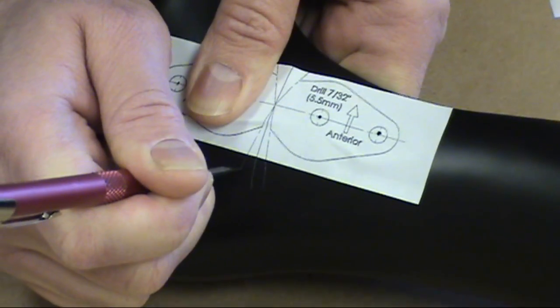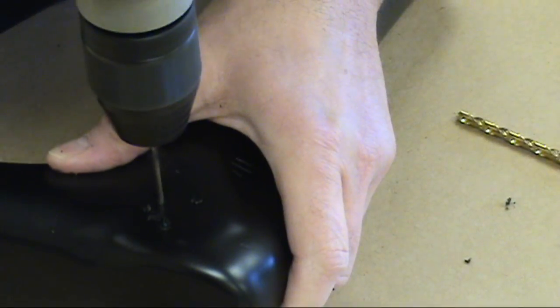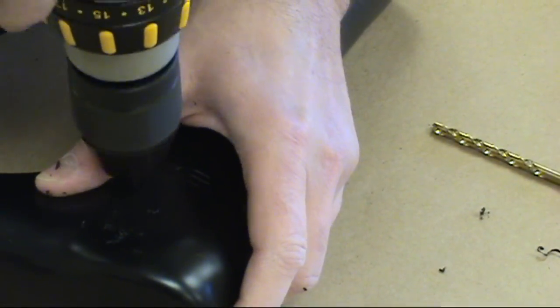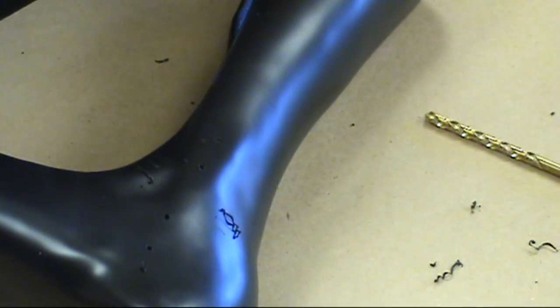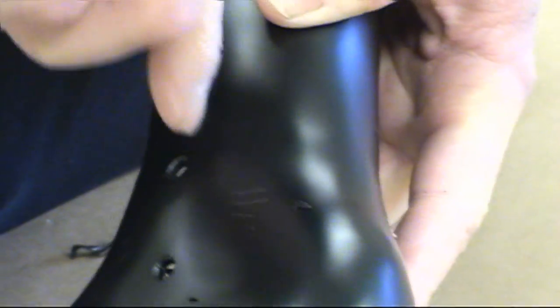Extend the trim lines on the drill guide template using a pencil or sharp object, then pre-drill the holes with the 3/32nds of an inch drill bit, followed by the 7/32nds of an inch drill bit, to get the correct hole dimensions. A deburring tool makes quick work of removing any plastic fragments from the drilling process.